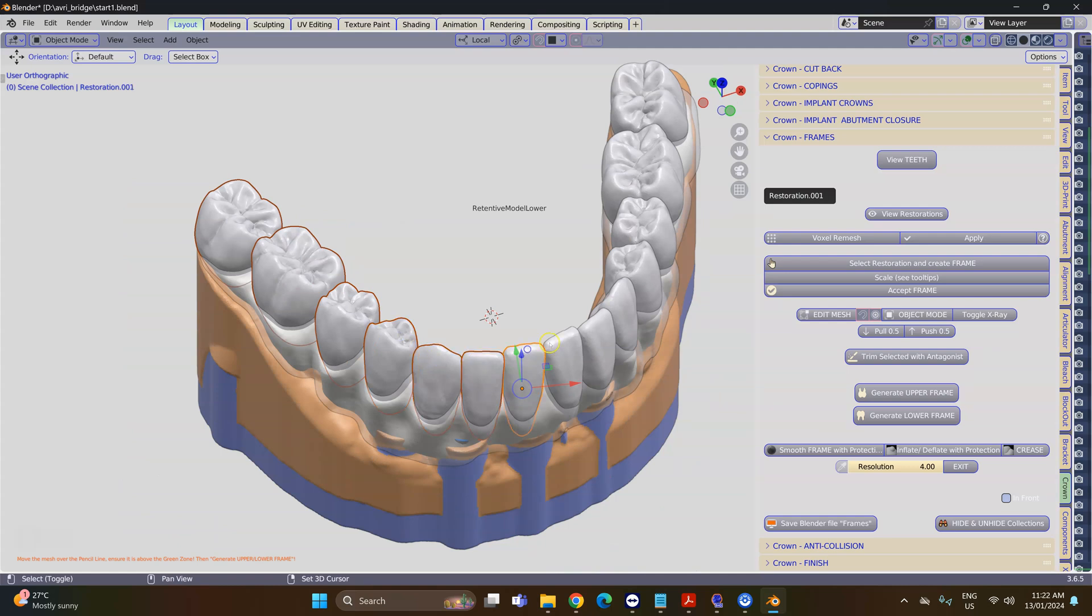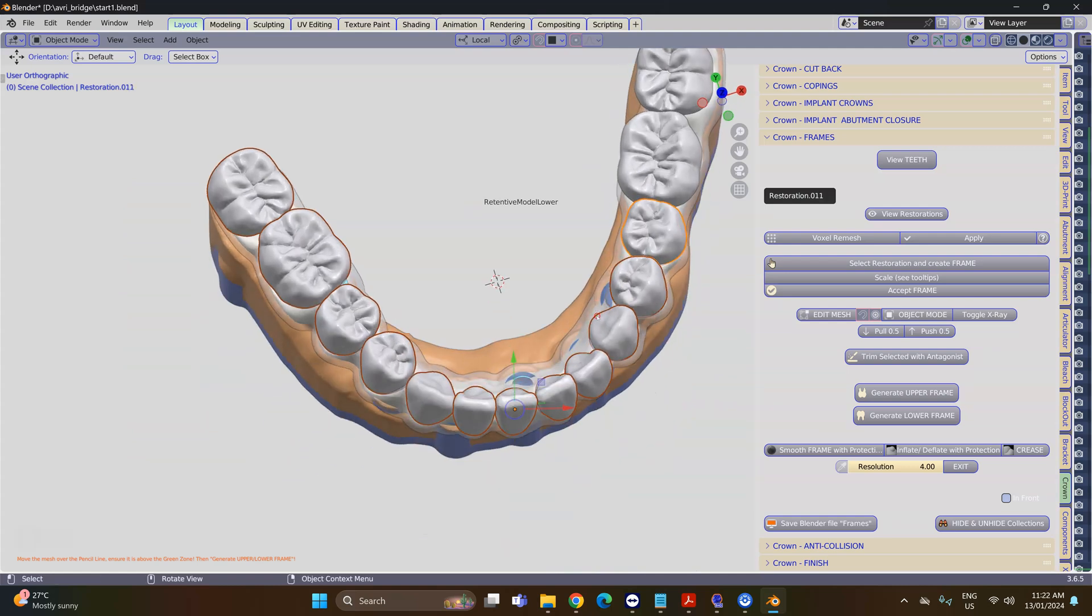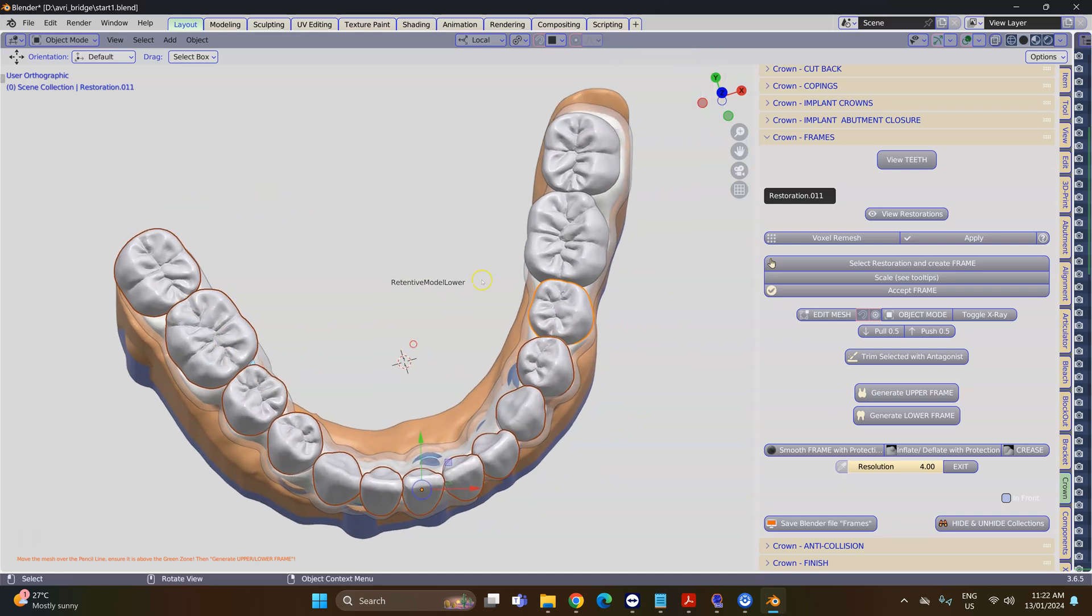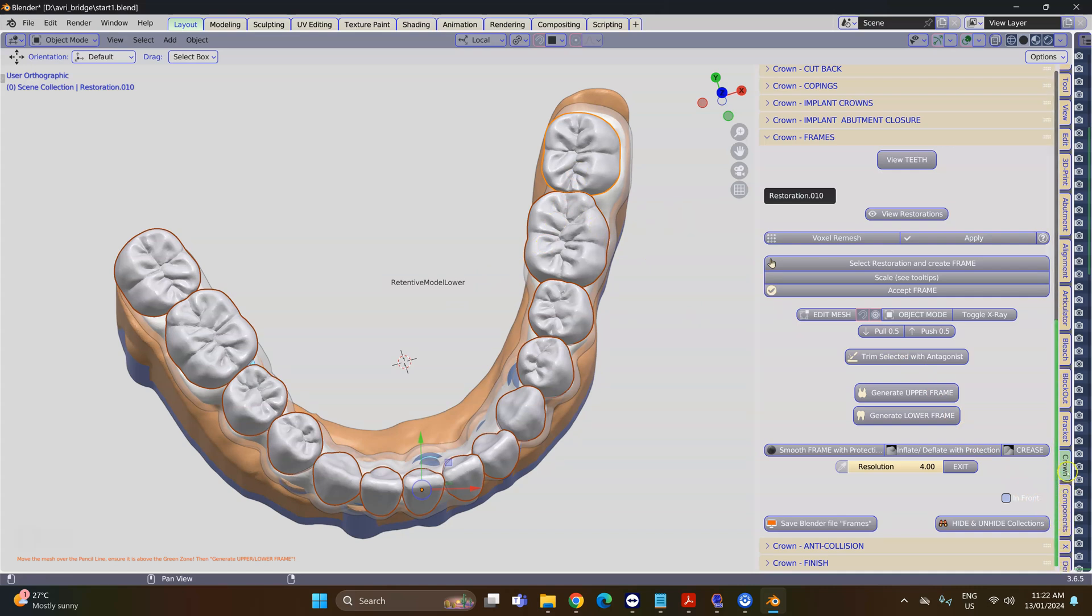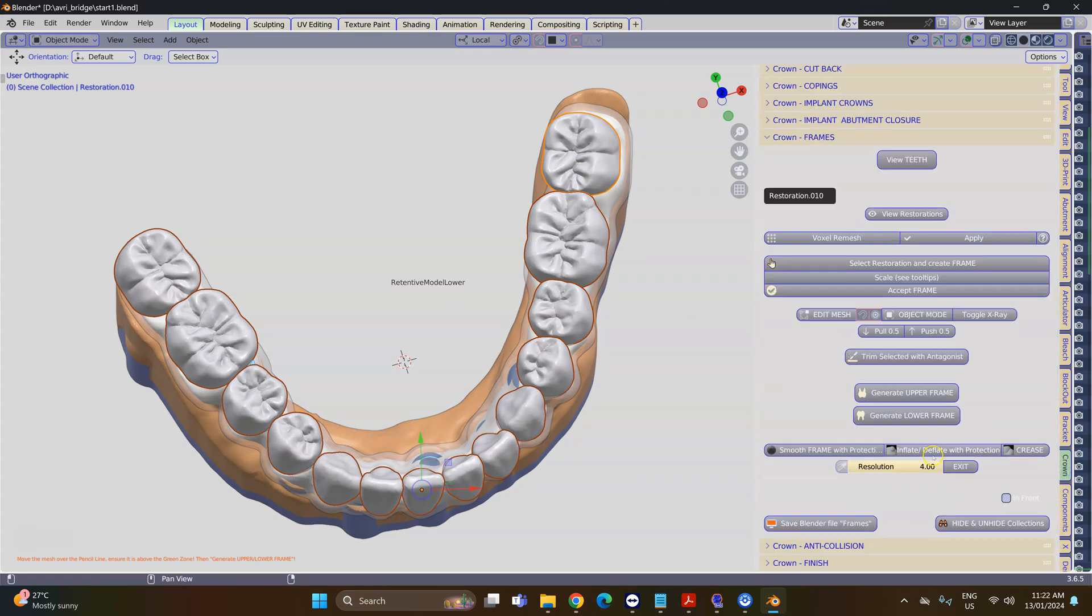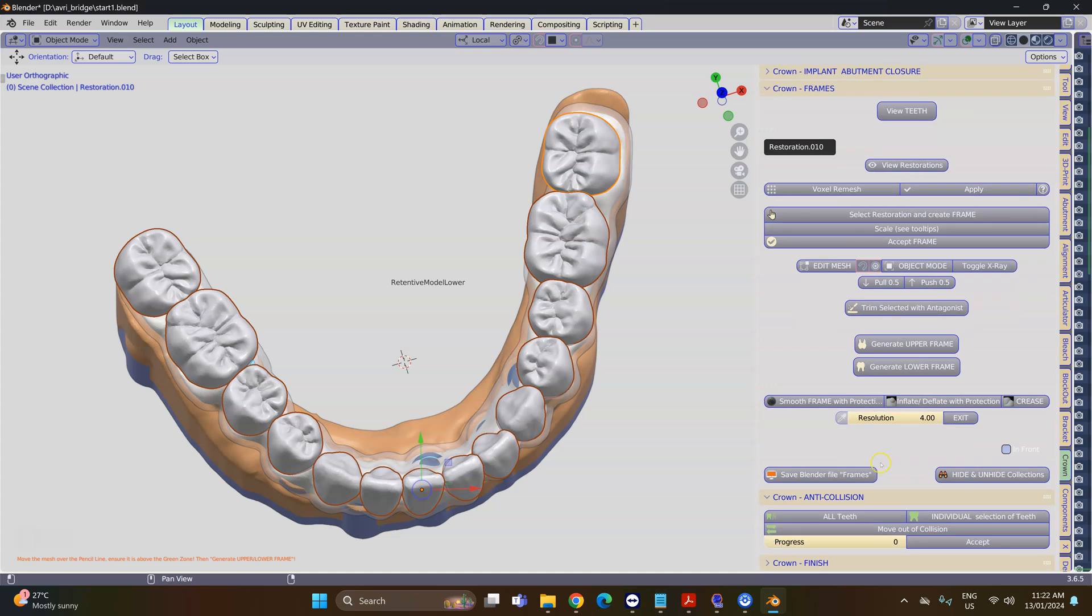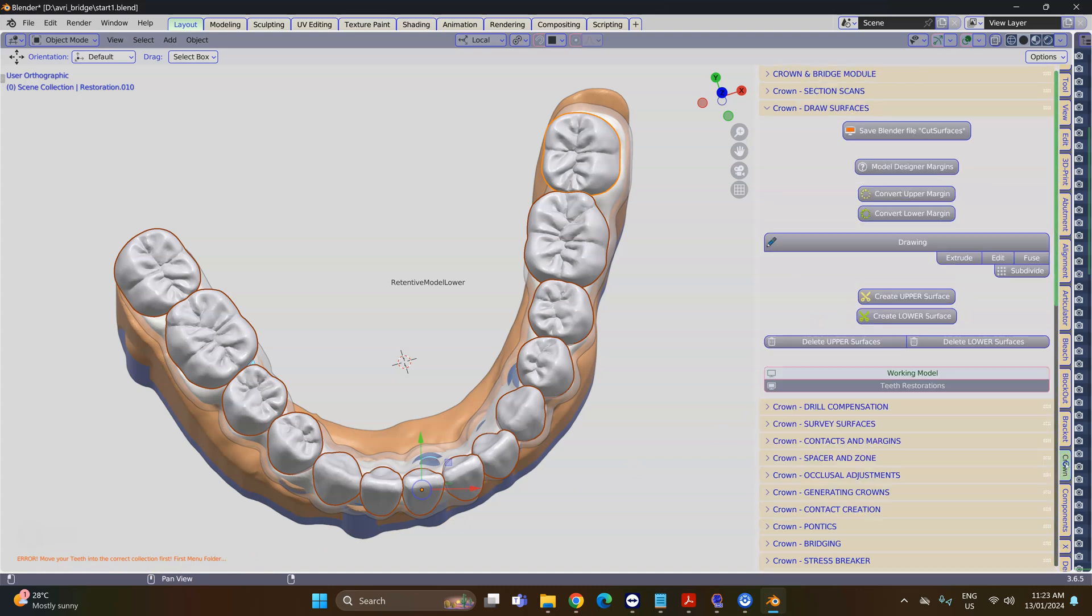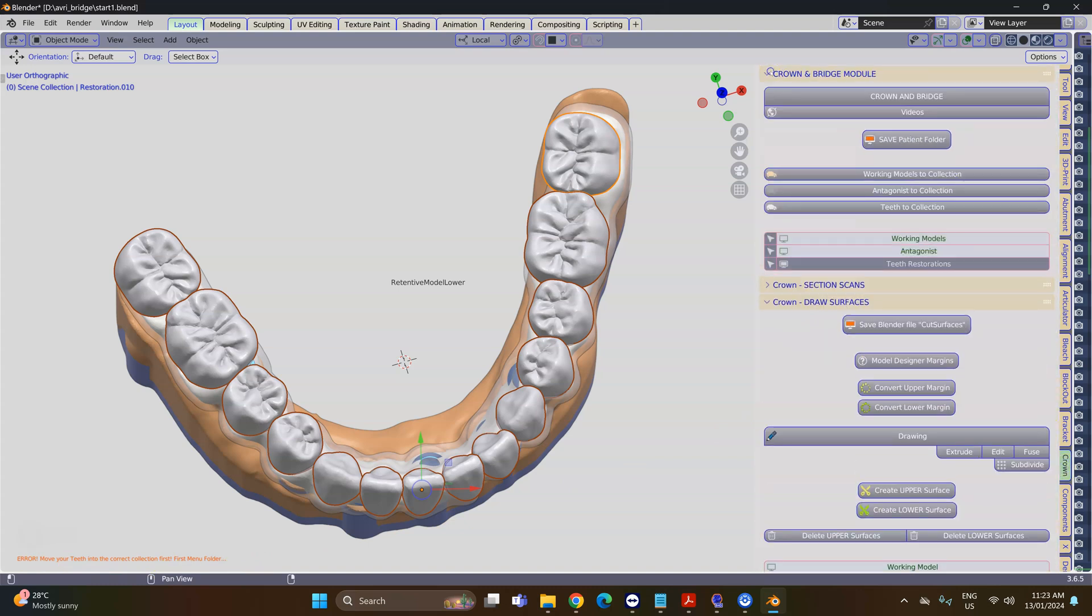Before we get to the cutting, I'm going to splay the teeth apart with the anti-collision tool. As they are set up, the contacts are very tight so I want to move them apart. I'm going to go to the Crown module, Anti-collision, and then click on Individual. Nothing's worked—always look at your tooltips, they will tell you what to do. In this instance it's telling me to move my teeth into the correct collection, which I forgot to do earlier.